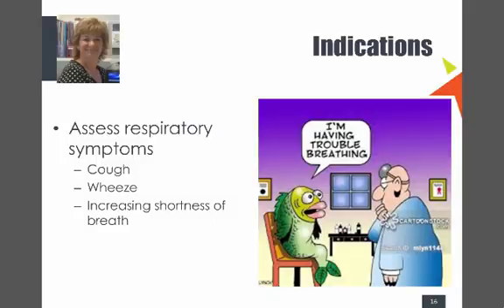Well, you might actually have heart failure, or she could have GORD, which is gastroesophageal reflux disease, essentially reflux. But those things often get mixed up, and I've seen people sent in to see respiratory consultants without spirometry who are actually in heart failure. So it's a good way to be able to do a breathing test and say, okay, is there narrowing of the airways? Is there restriction of volume? Is this truly a respiratory problem, or could it be something else? Because there are differentials that have the same types of symptoms.